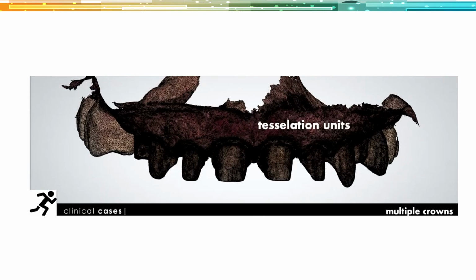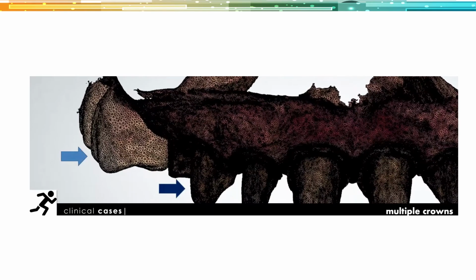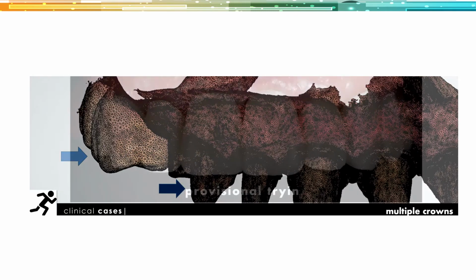And wherever we mark a tooth and we mark a preparation, you can see that the system preserves all the density of the triangles in that area. It basically post-processes out some of the extraneous data, like in this case, the areas that we didn't mark. You can see that there's a clear difference in the density of triangles. That's how we can manage the file sizes, and they become manageable files while still preserving the important data where we need it.